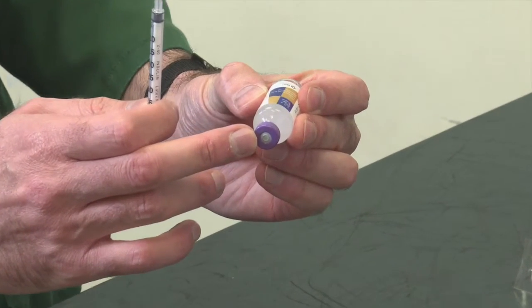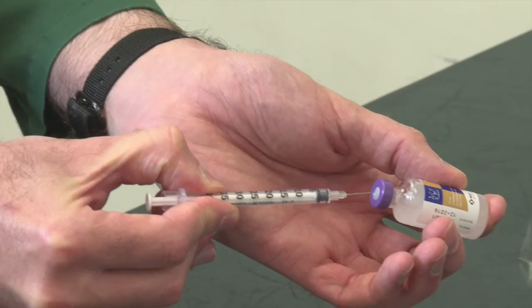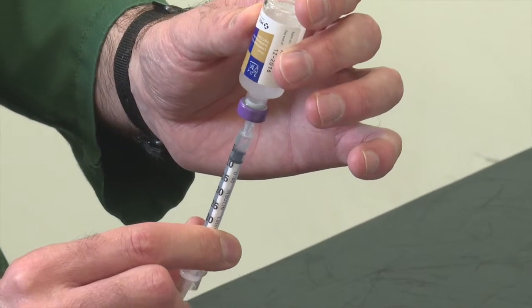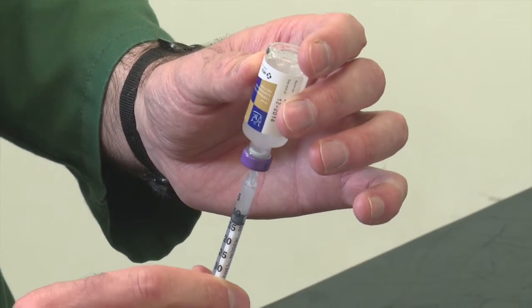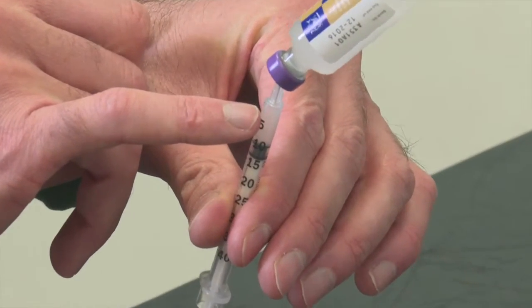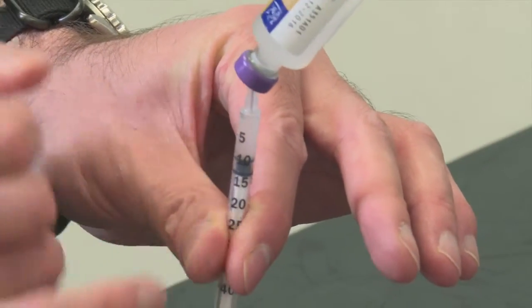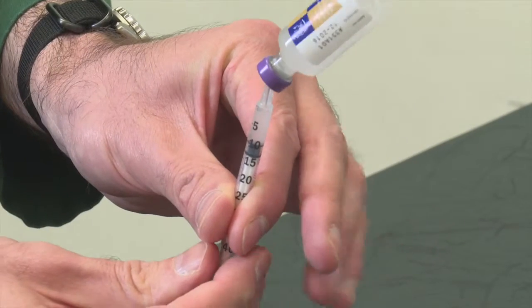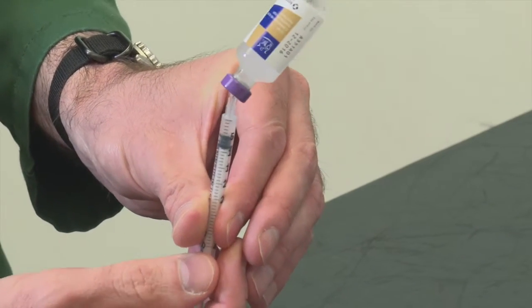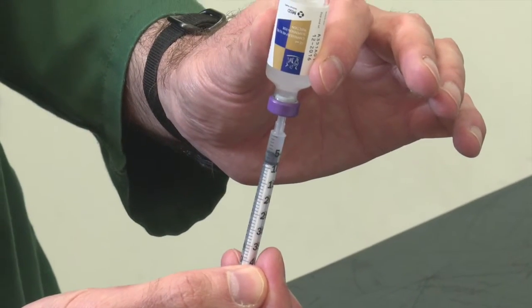It is very important we try to get the needle straight up the middle — into the centre of the bung and then straight up the long axis of the bottle. We are going to draw up the dosage. Often when you do this you will get a little bit of air at the top. If you do get some air, give it a little flick to get the air up underneath the needle, and then inject back so that you have got the correct dosage. In this case I have drawn up 5 units. Then withdraw the syringe from the bottle.